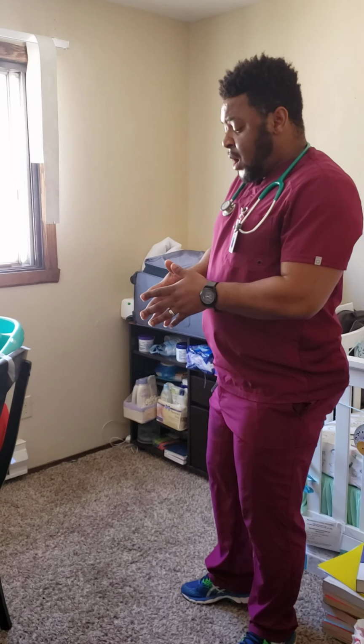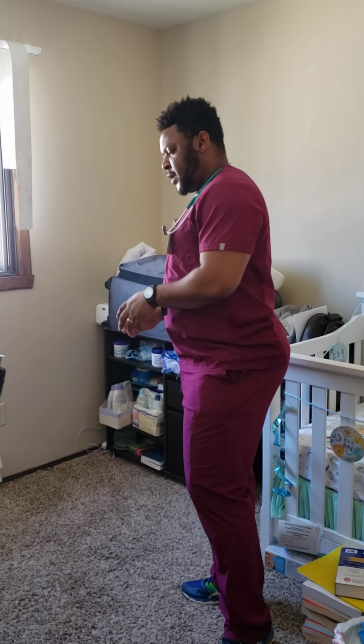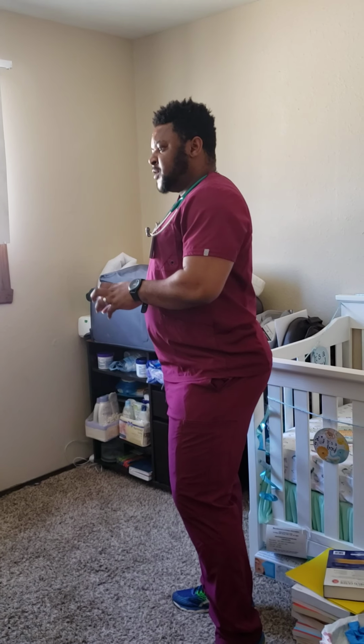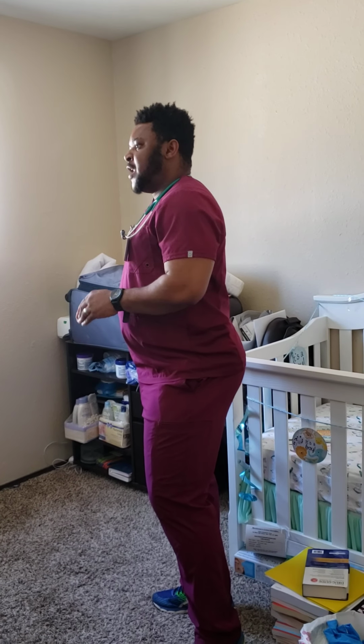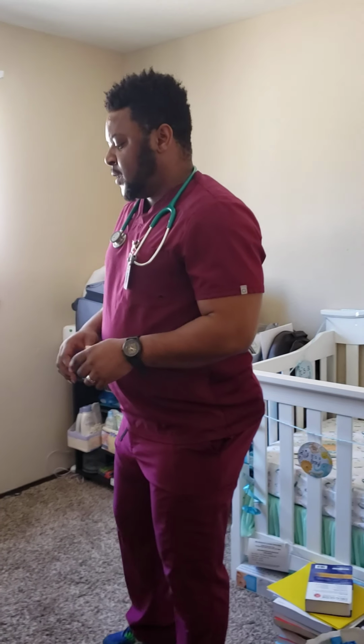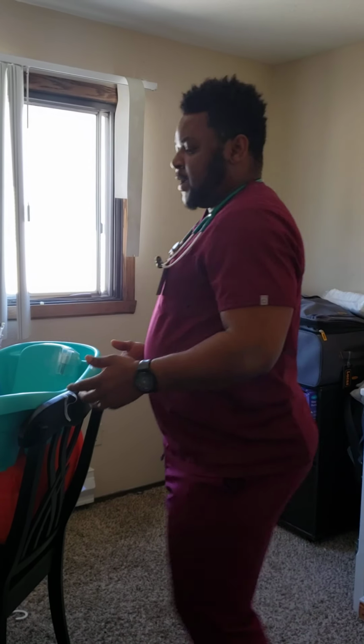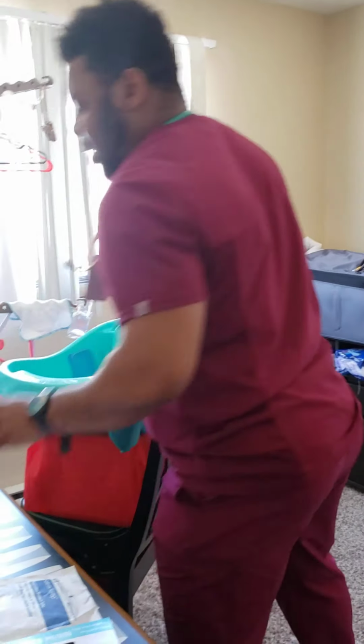To begin with, I'll go ahead and wash my hands and look at the doctor's order, making sure that I'm dealing with the right patient and I'm carrying out the right procedure, which is nasogastric tube insertion. Okay, after doing that, I'll come into the patient's room. After taking out my stuff and coming to the patient's room, here are my appliances right here. I'll be naming them as I go along.